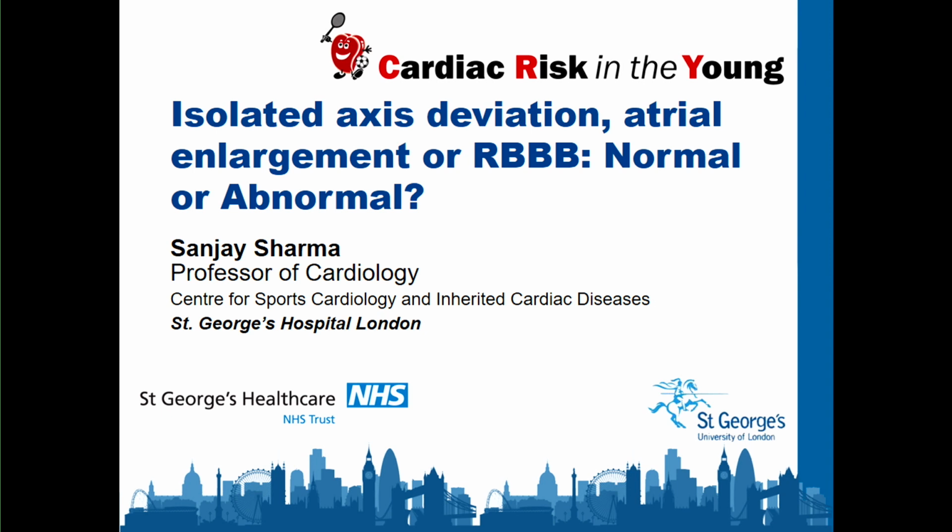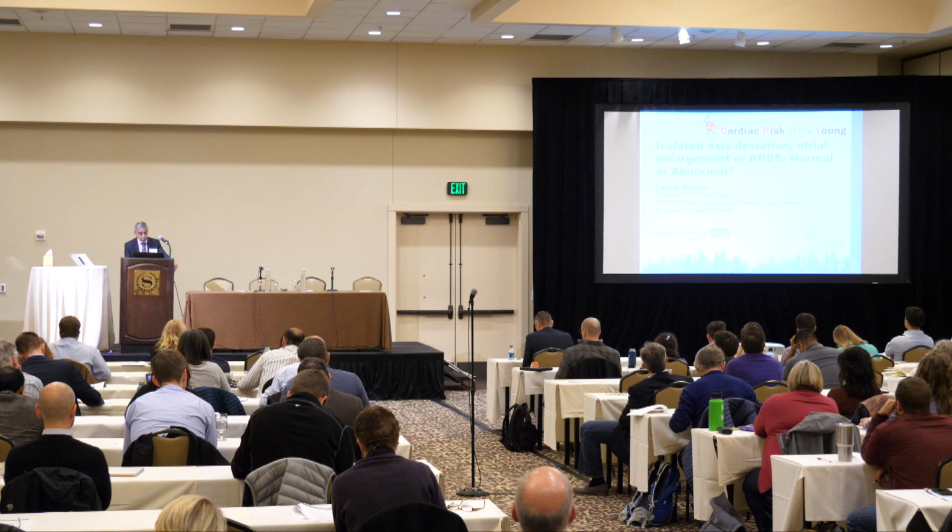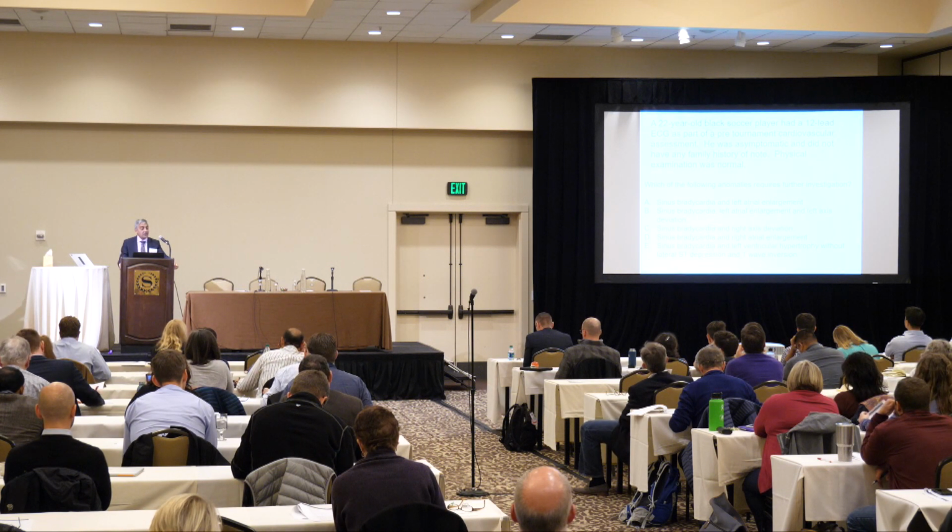So we're going to go from interesting things like pre-excitation, prolonged QT, and ventricular extrasystoles to things that are probably not so exciting, such as isolated axis deviation, atrial enlargement, and right bundle branch block. But let's start with a question.